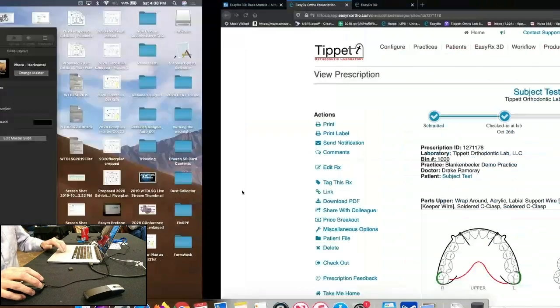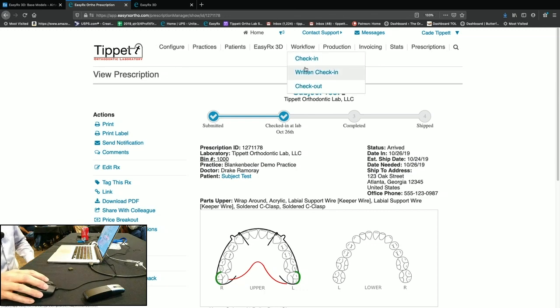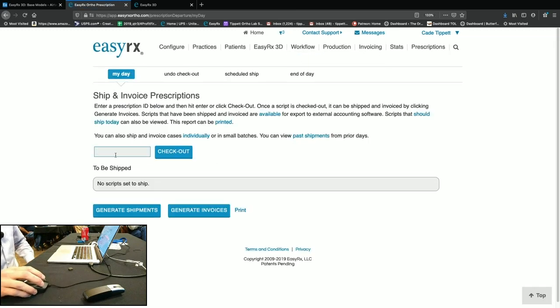So let's talk about end of day. So let's say we're going to check this out. It's ready to go. I can go to checkout. And then this is my favorite part. It's got a thing ready to go. I got a barcode scanner. And all the case bins that are done, I just go through and go boop, boop, boop, boop, boop, and scan them all, and they just start listing them down. And I have a video of that, and I didn't put it in the presentation, but it's really cool.